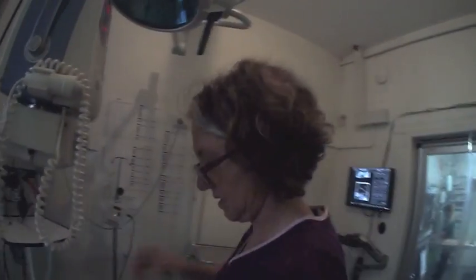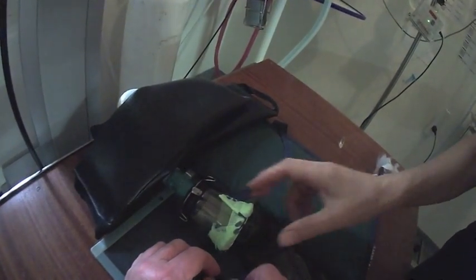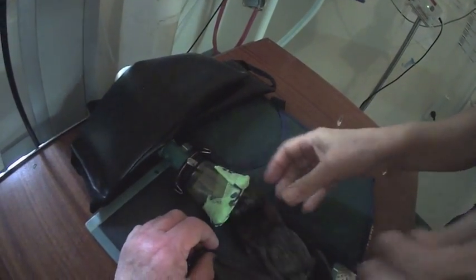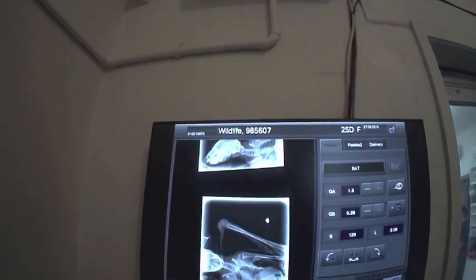Her forearm isn't growing the same as the other one, though. That's because she would have damaged her growth plate. Okay, well... do one just like the way you've got it now. It looks better.